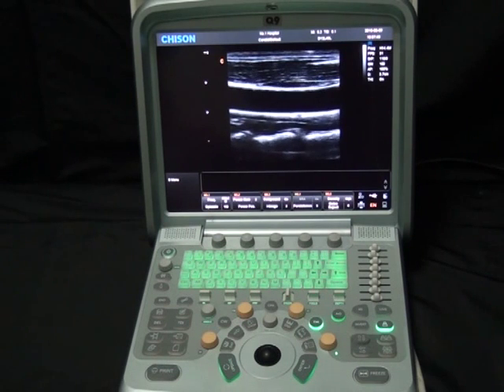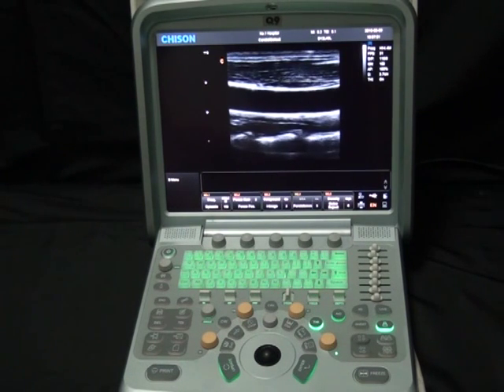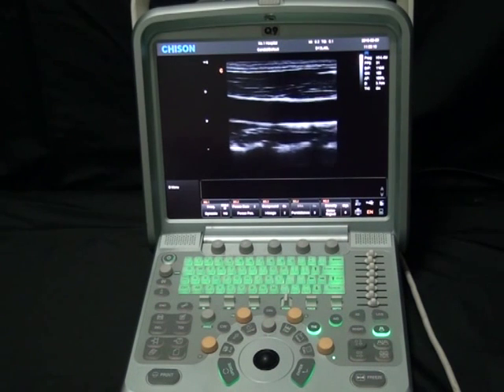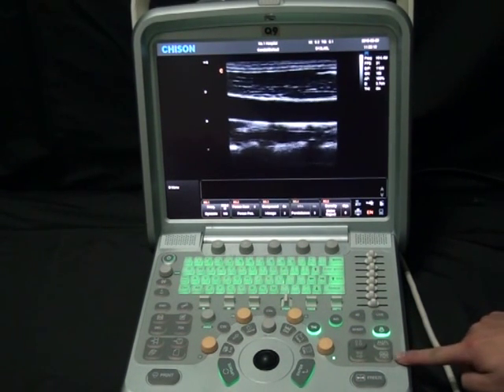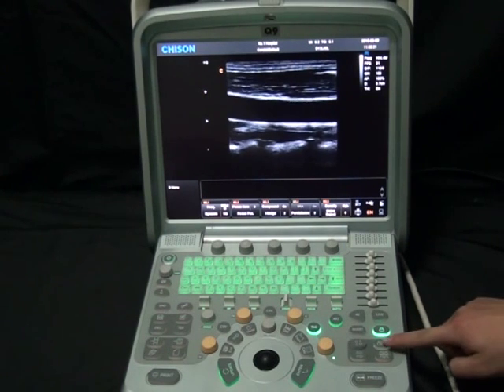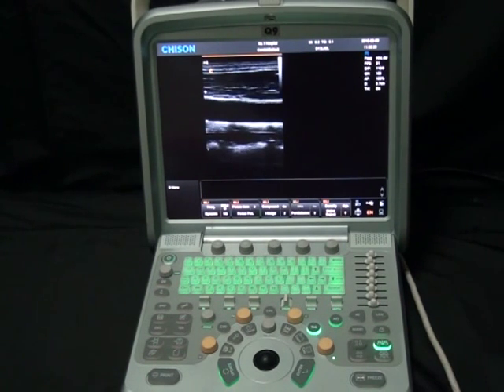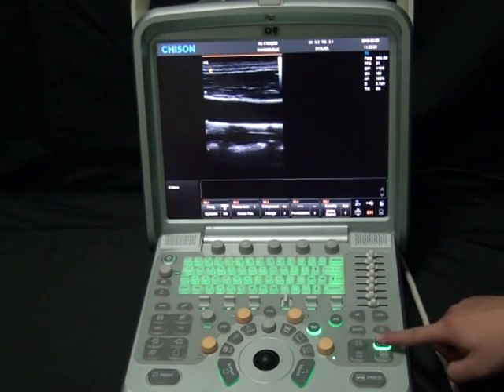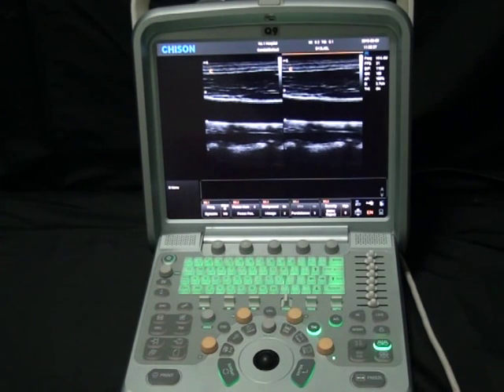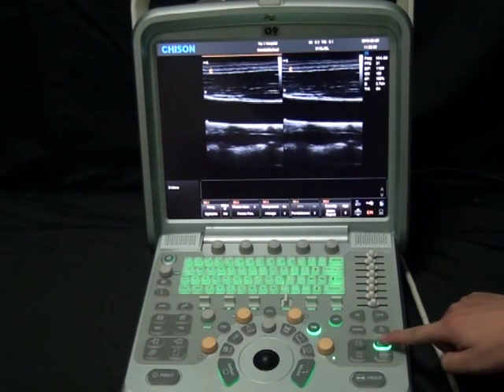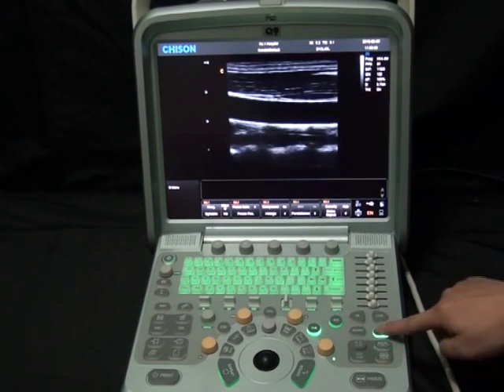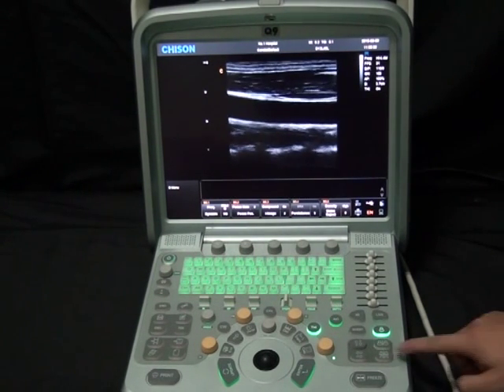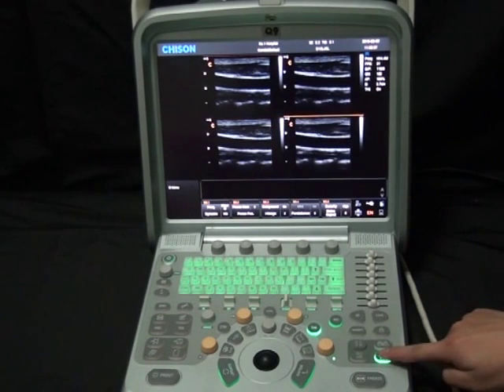Press AIO — with just one key, the image quality can be set to a suitable status. Also worth mentioning is that we have 2B mode and 4B mode. For example, in 2B mode, with a split screen, click to make the first panel active. Push again and the next becomes active. Back and forth allows you to switch between them. Push the single key to go back to single B mode. The same works for the quad screen.